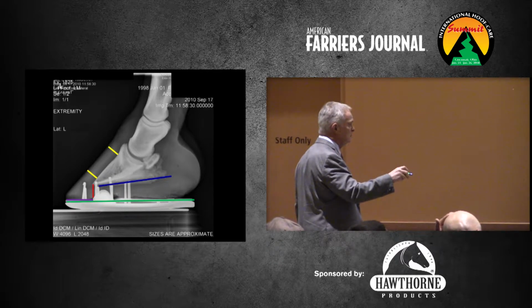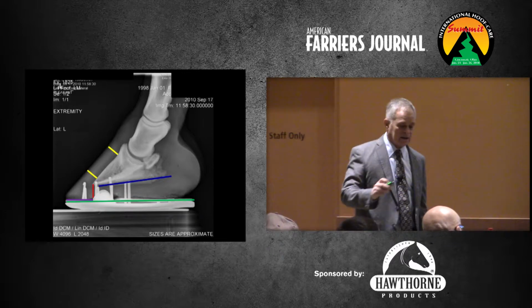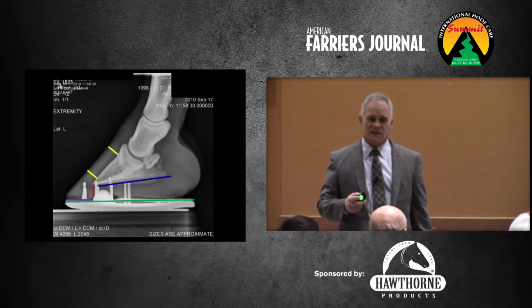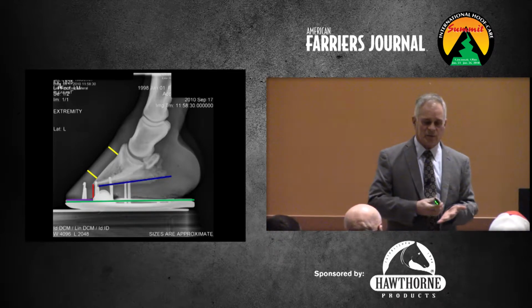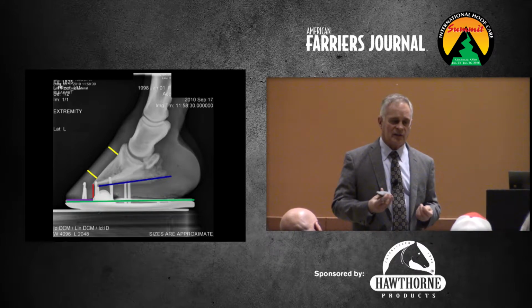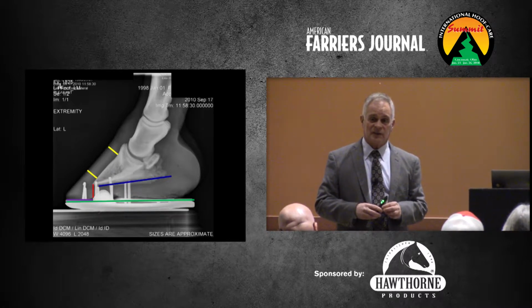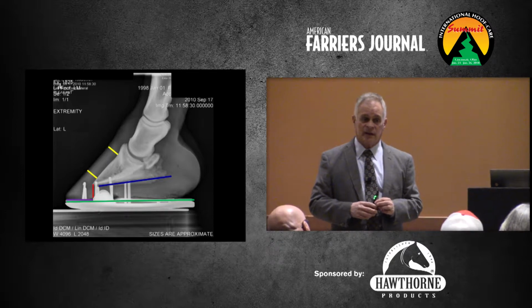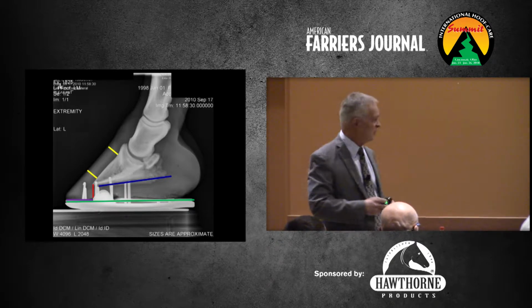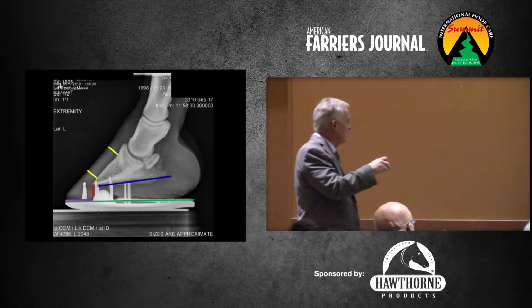Okay. The blue is our palmar angle. And again, Mr. Nunn went over that very well. We tend to talk about it as being normal anywhere from 0 to 8 degrees. There's no science behind that. That's just kind of our thoughts. And most commonly, probably we would like them to be 3 to 5 degrees. Right? And again, you can measure that, or you can just look at it and say, I think that's appropriate. So we're looking at the palmar angle of the coffin bone.